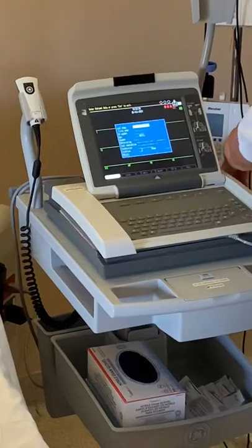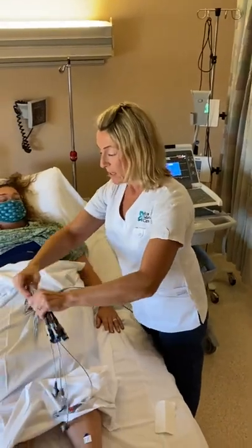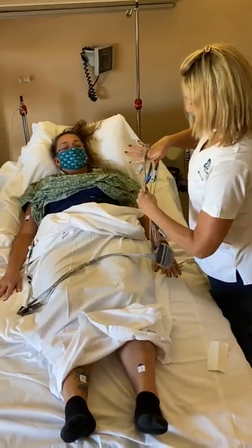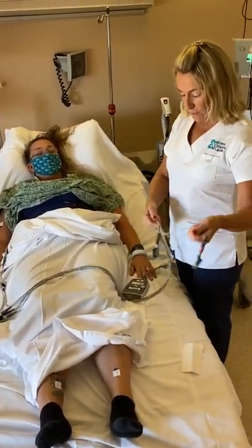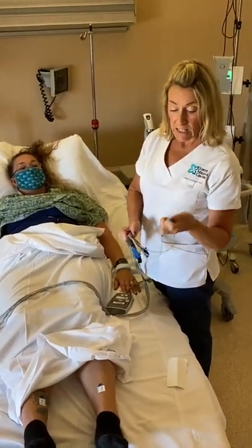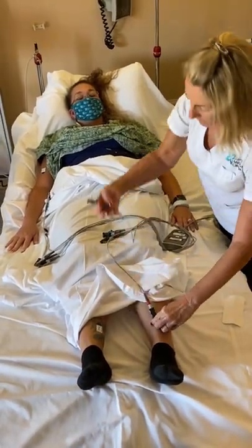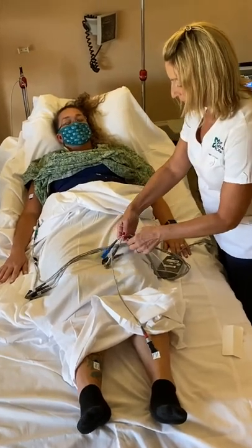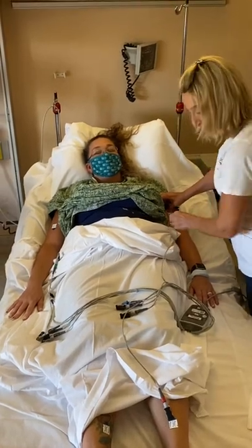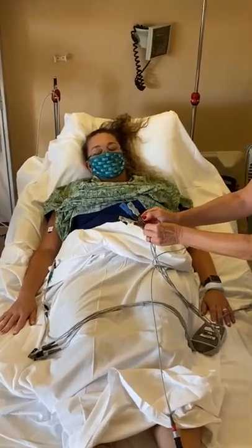The next part is the most important part, and that is putting the EKG leads attached to the right part of their body. So we call it a 12 lead, but it's really only 10 stickers. So left leg, left arm. Does it say it on those wires? It does. Let me show you, Mrs. Little. Excellent question. So now we're going to do 4, 5, 6.